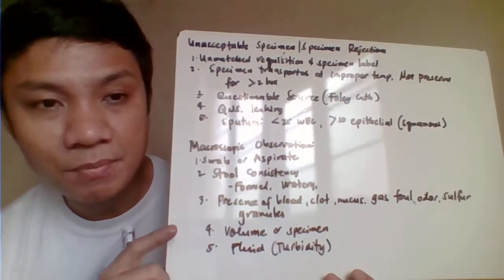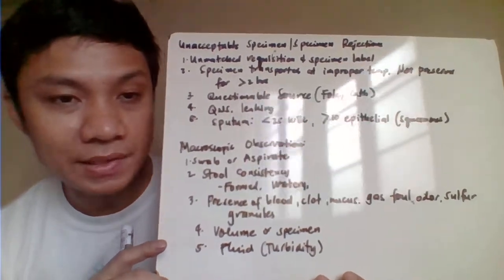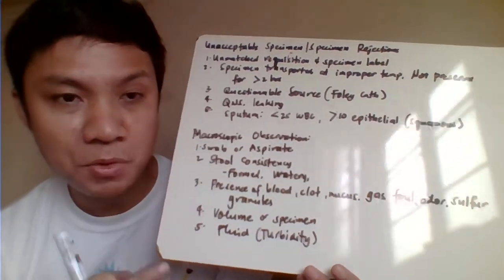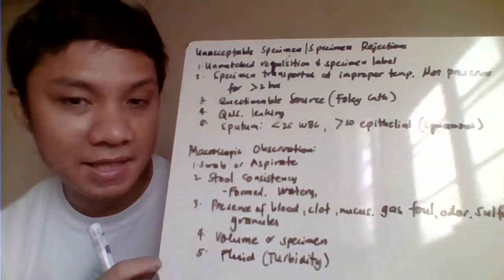Another one, with the stool sample here, you need also to indicate the consistency. Is that a formed stool? Is that watery? Is that mucoid? Okay, so dapat naka-indicated siya.